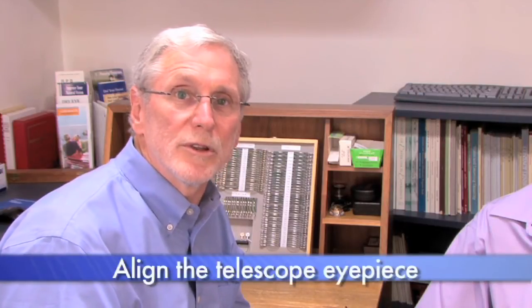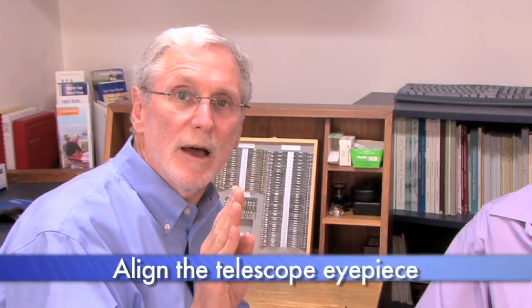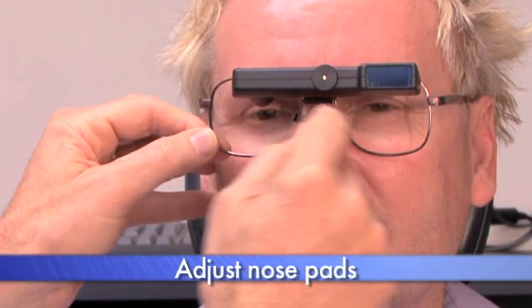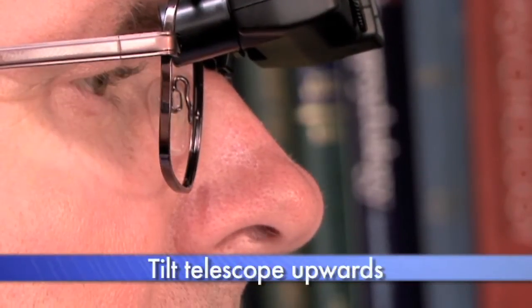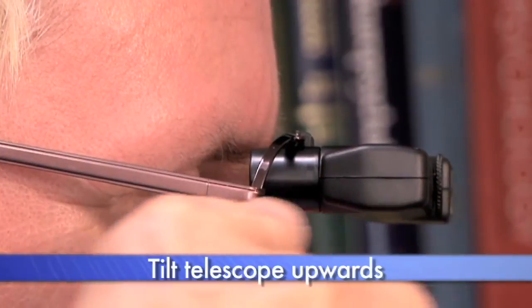In summary, there are three steps to fitting the ESK and the ES Sport. Number one, loosen the bridge assembly so you can move the telescope right to left to line it up with the eye, positioning the eyepiece right above the eye that will be looking through it. Step two, adjust the bridge assembly so the bottom of the eyepiece lines up at the top of the pupil. Step three, change the angle of inclination so that when the patient drops their head down, they're looking directly through the eyepiece.